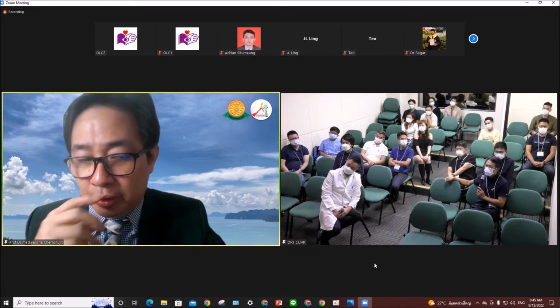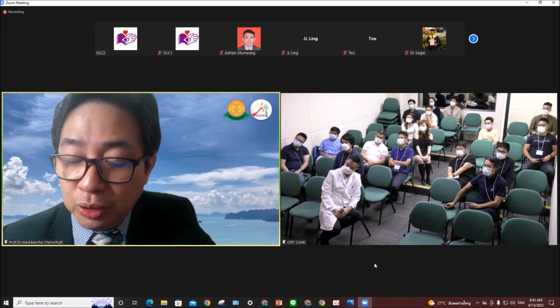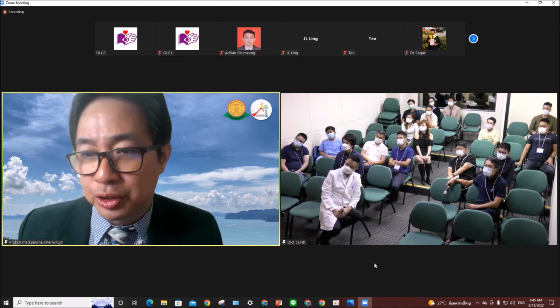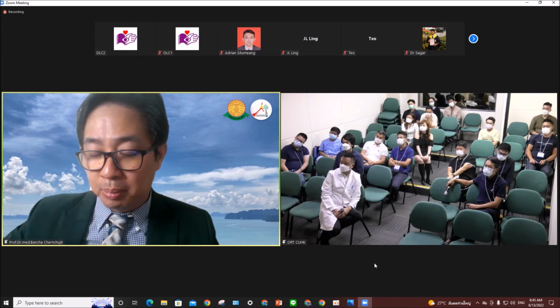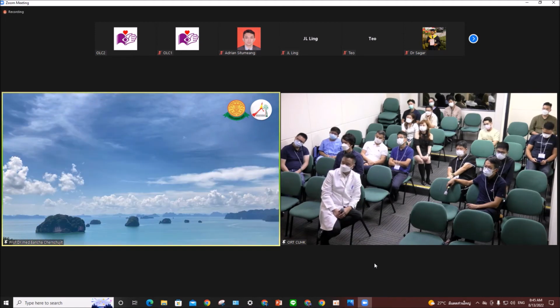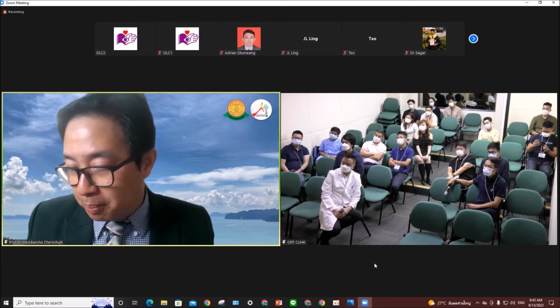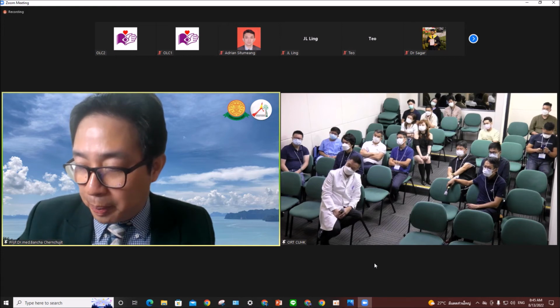I think the tip is that the anteroinferior portal is just above the subscap, right? So if the piece of bone is big, you cannot hook around because you're coming from the top and you need to repair the fragment that is lower. It's impossible using the spectrum or the Accu-Pass to pass through this.